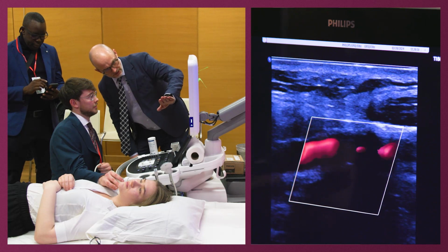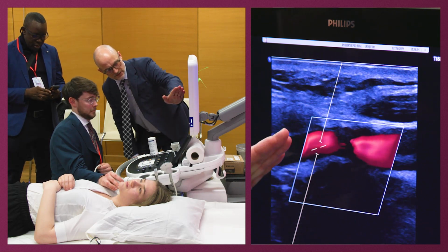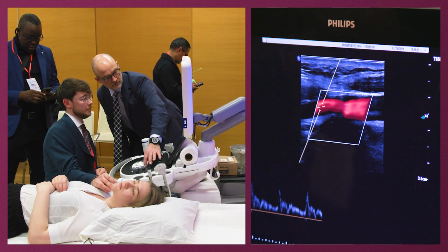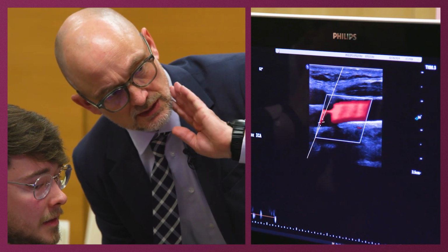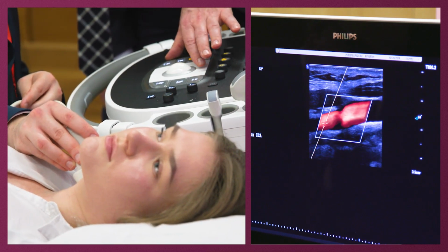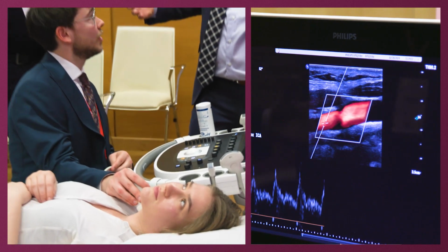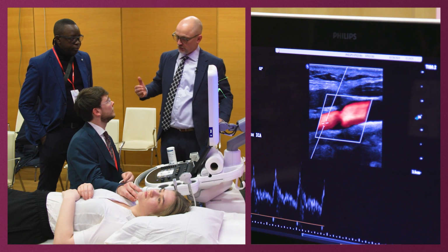So let's focus on this one. Stop. Have a steady hand. I'll help you with the buttons. I put on the Doppler curve. I'm not quite satisfied with the angle here, so I use the steering. That's better. Yes. Perfect. And then can you move the transducer a little bit towards the head? Yes. Nice. Stop. You can see all this blood is running into the brain in the diastole, so it's the internal. Then you could start looking for side branches, tapping, just to be sure.